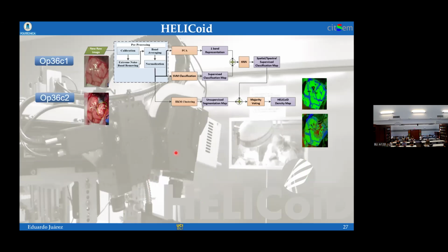These are the results we get for this patient. This is before the brain tumor is removed. This is after, or during, the removal of the brain tumor. So first we have normal tissue, capture number one, capture number two. We see the glioblastoma grade 4 that this patient had. These are the results we get with the algorithm. Here, green means healthy tissue, red means pathological tissue. So functionally, it is working well.